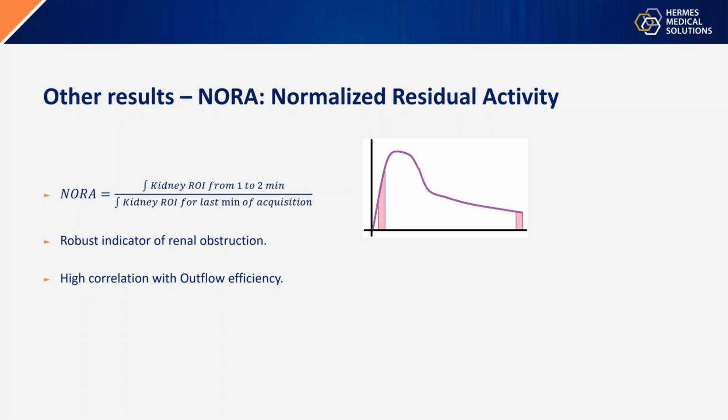On the other hand, if we were to remove the C-shaped background, then we would have the problem with the tissue background instead. So while it's true that we might be doubling up a little bit, it's still the best of many worlds. I hope that answers the question. Okay, great, thank you. We have another question.